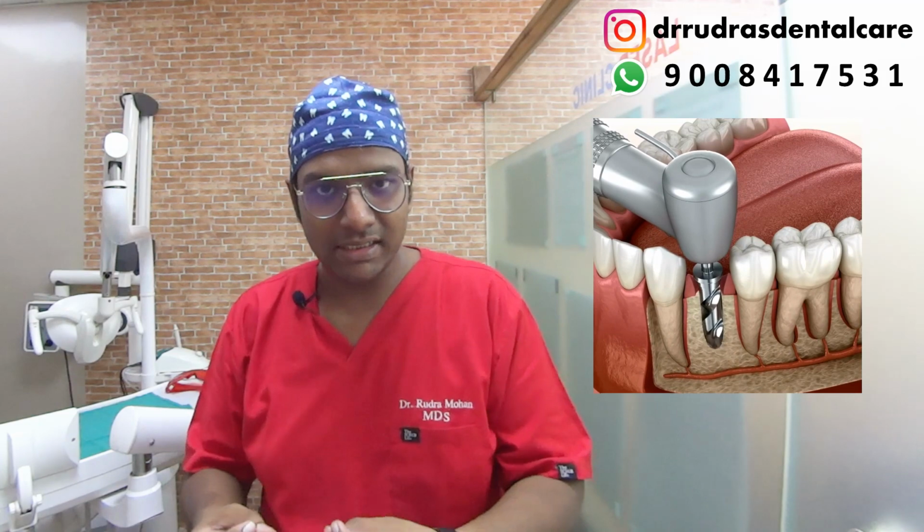So today I'm going to be talking about basal implants and basal implantology. We've already talked about conventional dental implants in detail in the previous episodes, wherein basically using the element of titanium, that is the metal, which is biocompatible and inert, it helps in association with the bone, so that the bone can grow around it in the form of osseointegration.